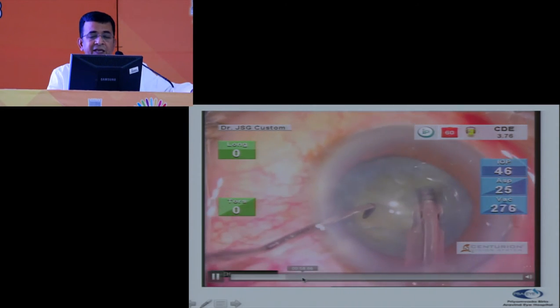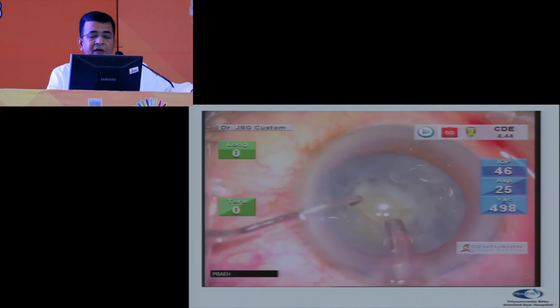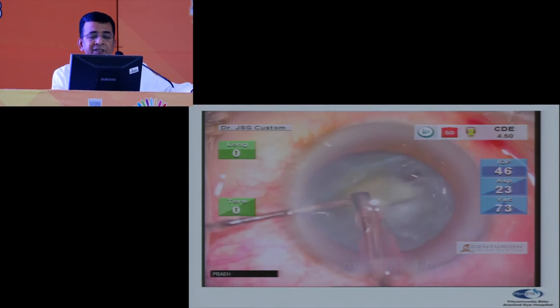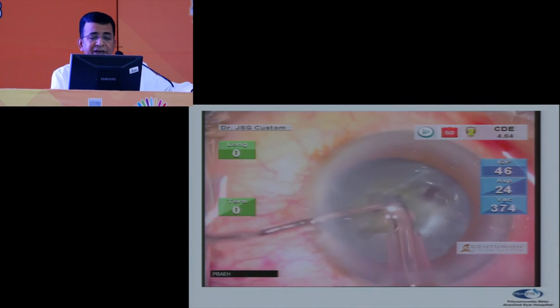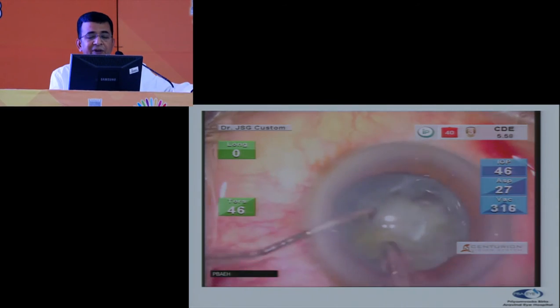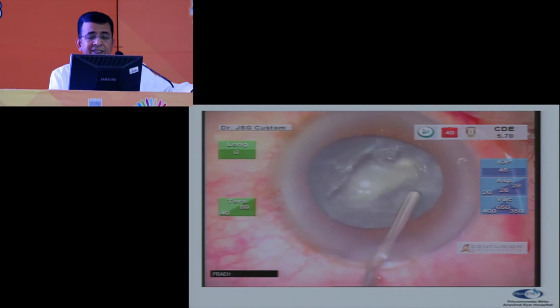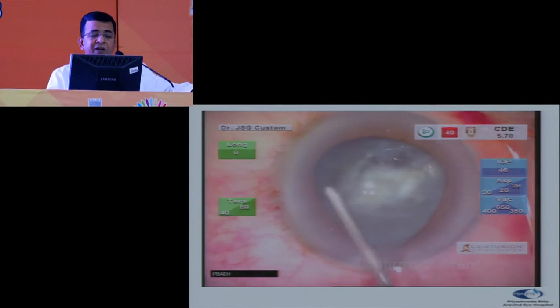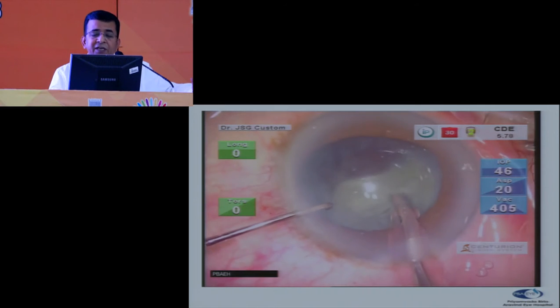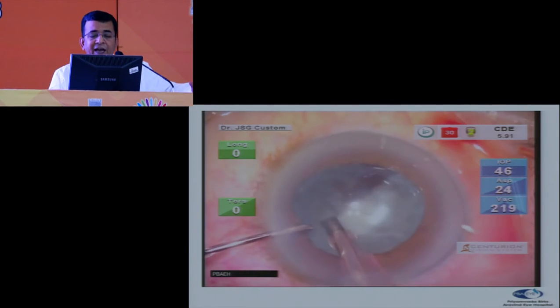And then as my pieces are coming in, I'm sure nothing is there at this point of time. And then when I try to rotate, I see something. There is a clearance. I think there is a rent, but I'm not sure whether there is a rent. There should be a rent. So that piece also comes up. I cannot see anything underneath. My epinuclear plate is well in position. So I replenish with visco. And as I go for my traditional technique of putting in viscoelastic under the epinuclear plate, I find the iris is coming down. So I am sure that there is a rent, because the visco goes down, gives a positive pressure, and the epinuclear plate comes out. So in spite of that, I can continue with my process.